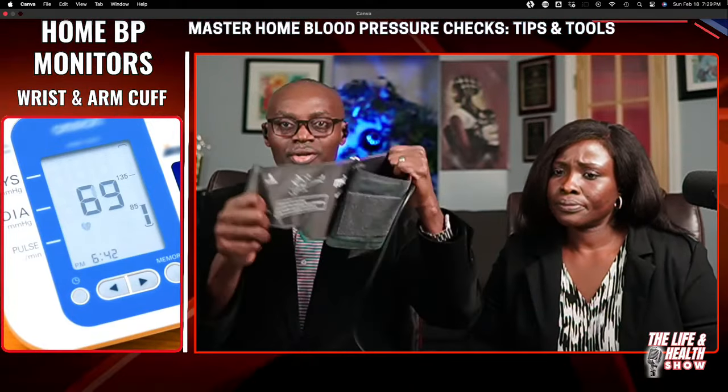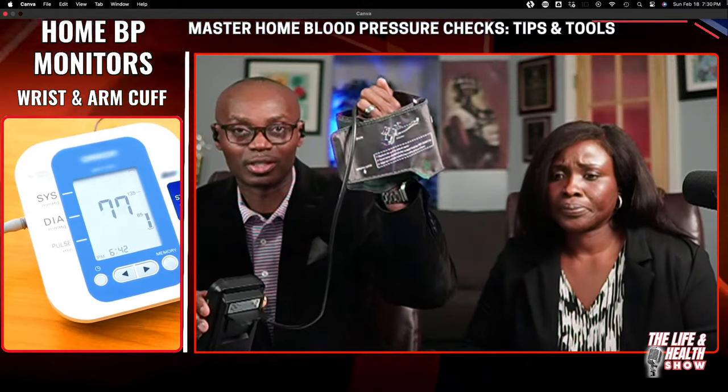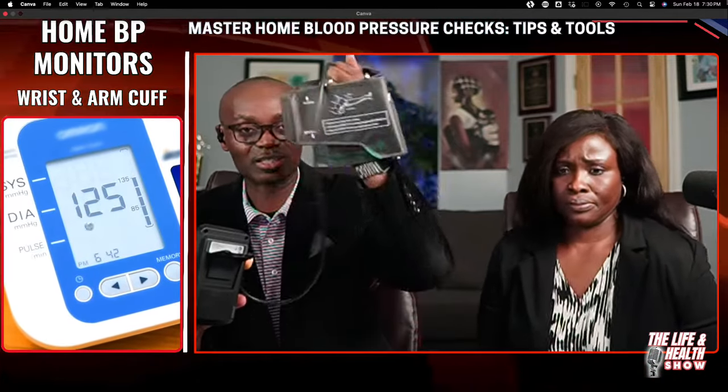And this, as you can tell, is the arm cuff. It's got a tube, and it goes over your arm right here, and then you inflate. The machine is separate, so you see the machine is different from the cuff. The wrist one, all of it is together, and then you tie it around your wrist. So we prefer that you go with a device that has a separate cuff and a separate machine connected by a tubing, and then you use it that way. That is what we prefer. At least it's not just we; that is what studies show are the best ones.